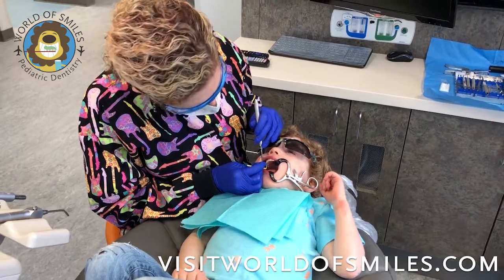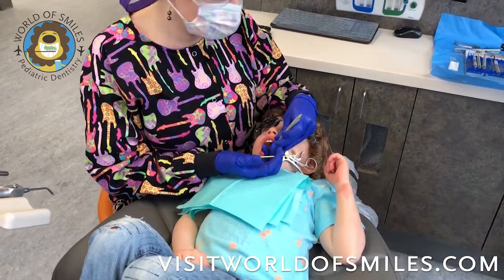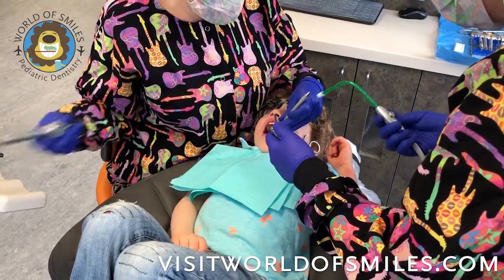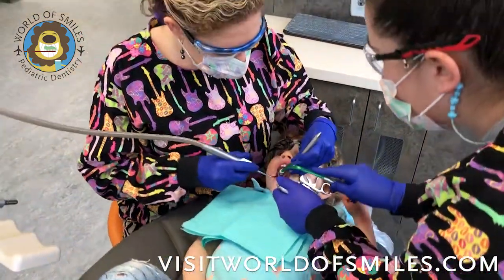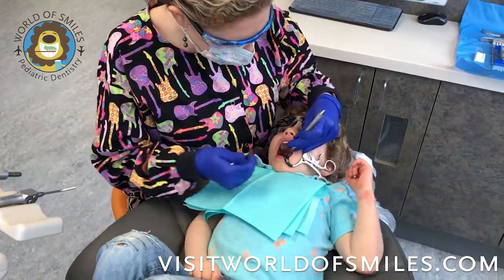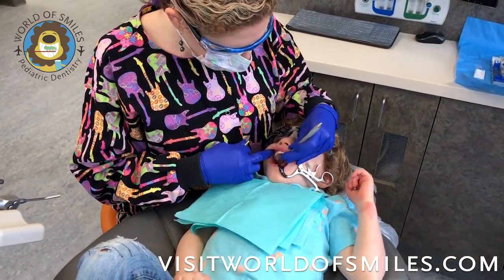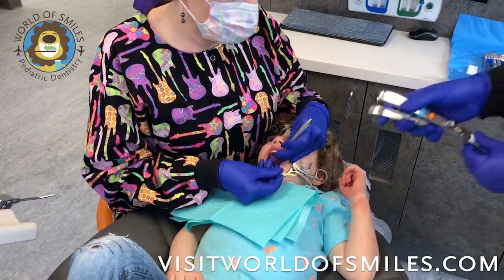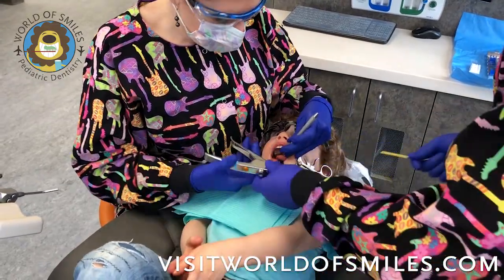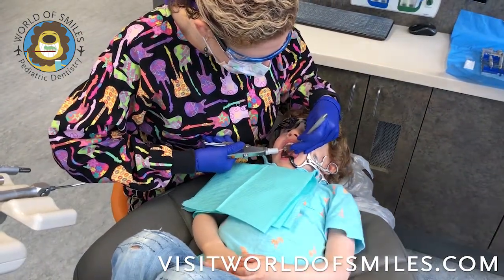After you scrub those teeth and get them nice and clean, we will go ahead and rinse that off. Once it is nice and rinsed, it doesn't need to be bone dry for the glass ionomer — we will want it to be even slightly moist, but not dripping wet. Then, after your assistant has activated the glass ionomer, in this case we're using Fuji 9 that is not light cured.